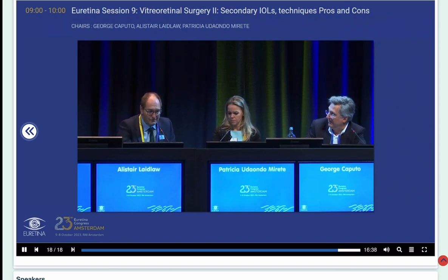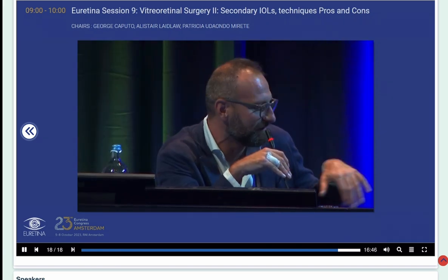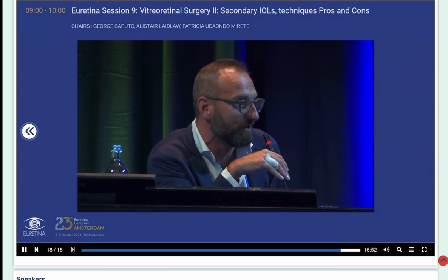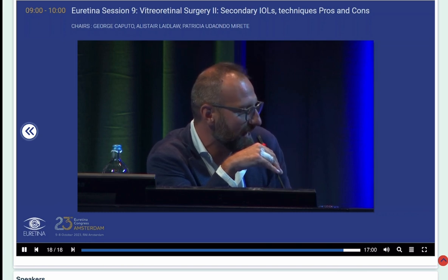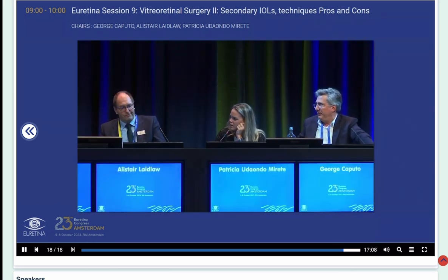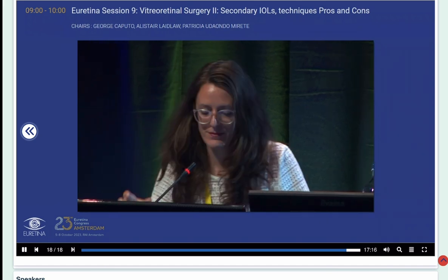I always had a problem with the concept of anterior vitrectomy, because I never understand when it stops, the anterior, and starts the posterior vitrectomy. So to me, a vitrectomy is always full, maybe avoiding a very precise shaving of the base, but I do a complete vitrectomy. Elise, last comment? Yes, for the Yamane technique, I think a full vitrectomy is mandatory because you work quite close to the base, so I would not risk it. Yeah, full vitrectomy. Okay.